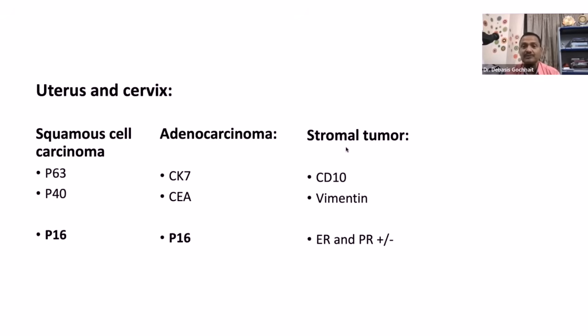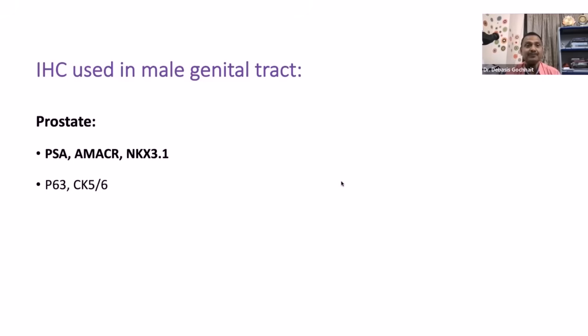That is not a very important point of view, but if somebody wants to remember a marker for stromal tumor, that is CD10. Okay, so that was about the female genital tract. Now we move on to the male genital tract.